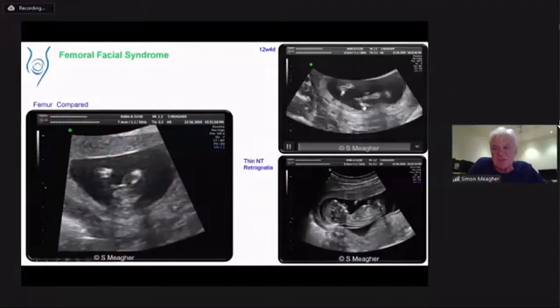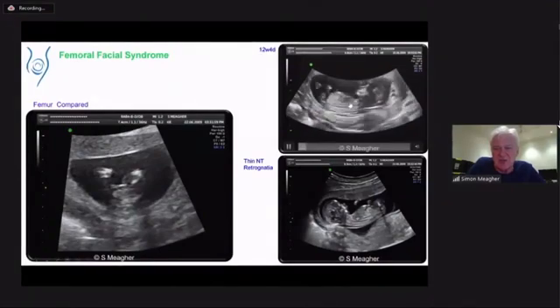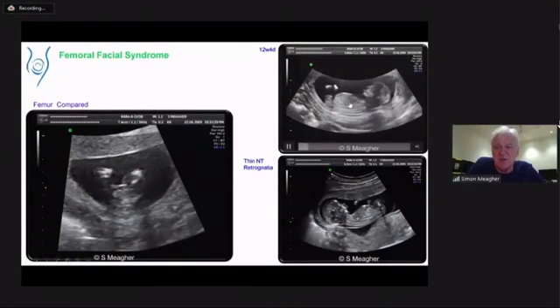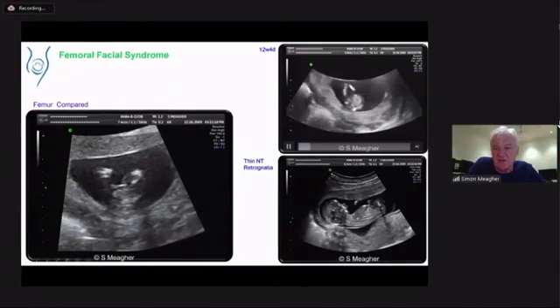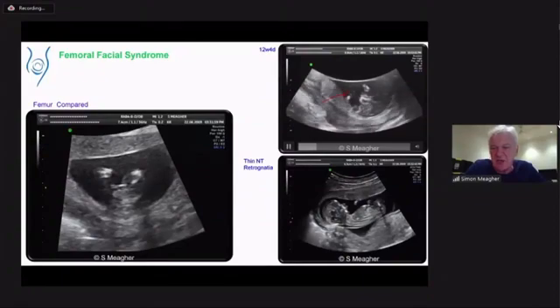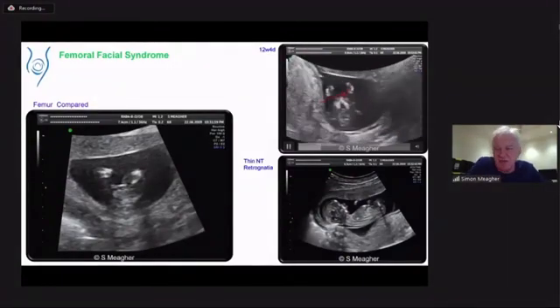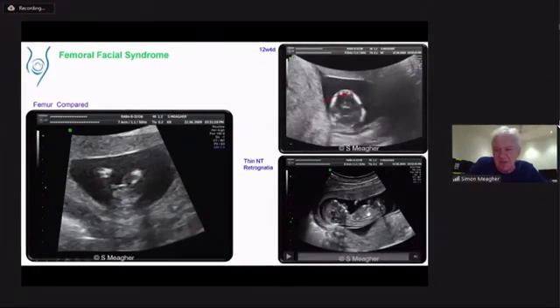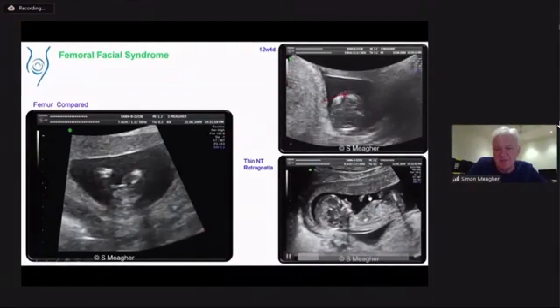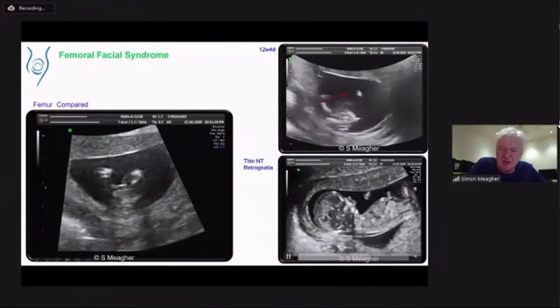So this is a fetus at 12 weeks and 4 days of gestation with a thin nuchal translucency. As you scroll across in sagittal, you see nothing of note. And then when you sweep your transducer into a transverse section, you see a normal looking femur, as I say, occupying 7/8 of the limb. But when you go to the opposite side, you see a very different appearance to the femur on the other side. So we come down to the bottom right-hand corner to give you more details. The bottom right-hand corner also shows that the fetus has got retrognathia.